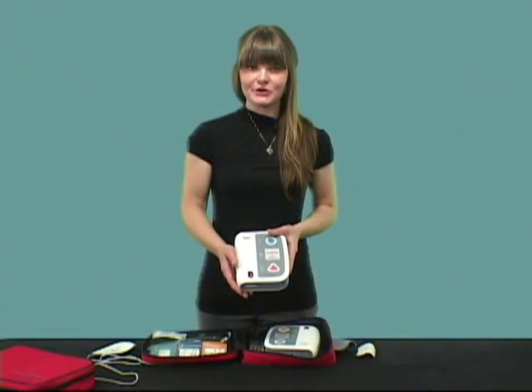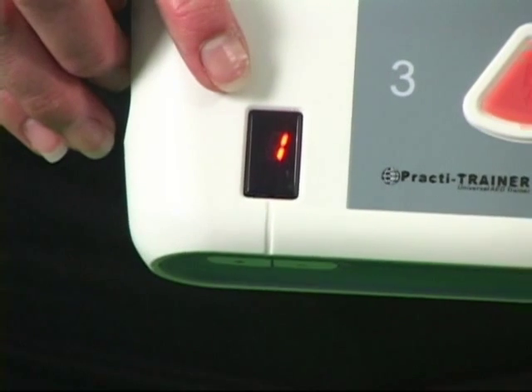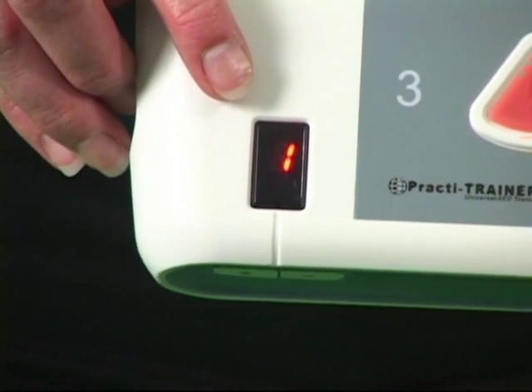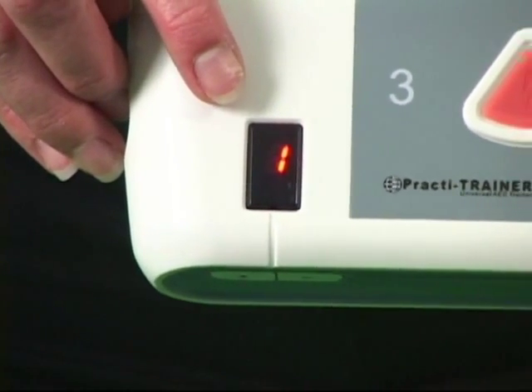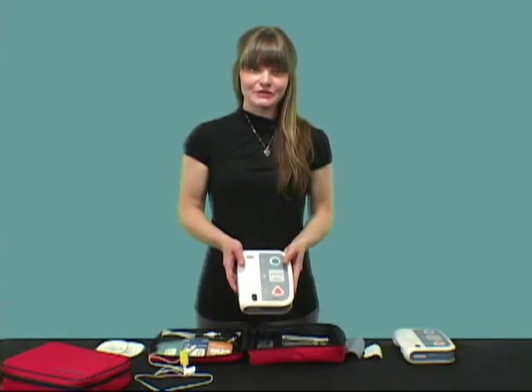To use the trainer, first choose one of the eight different programmed training scenarios. The indicator on the lower part of the front panel identifies which training scenario is selected. Let me demonstrate how it works.